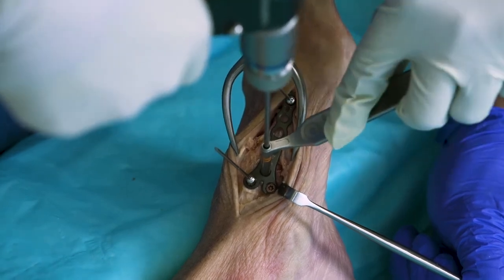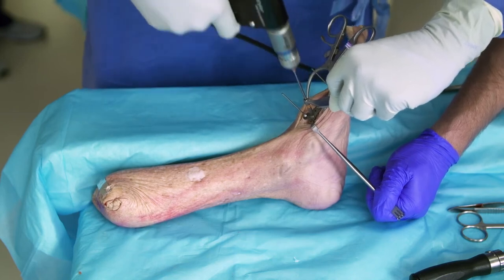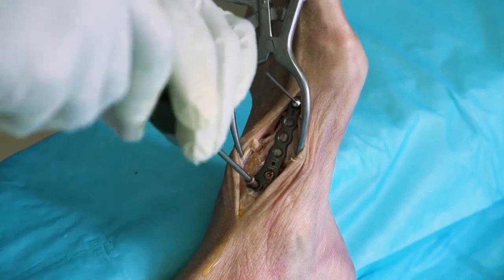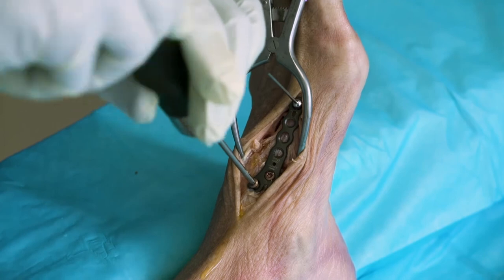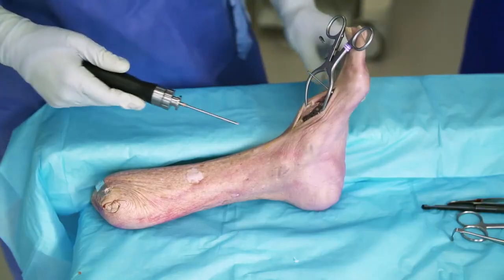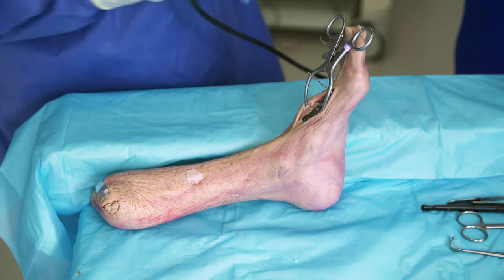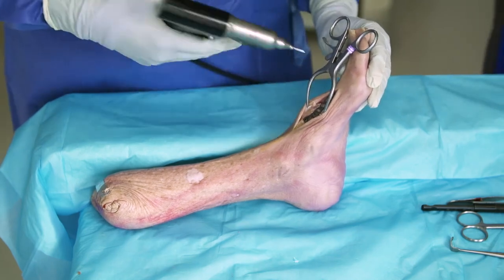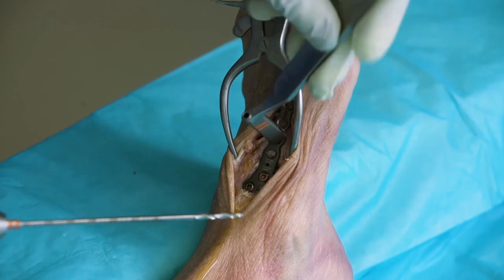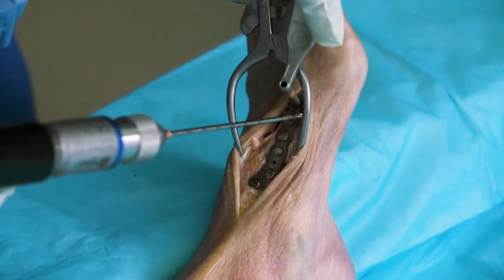You have to ensure that the screw does not cross the tarsometatarsal joint, which you can confirm on fluoroscopy. Once the screws go down, we'll have three points of fixation on this plate. The plate can't really rotate once there's fixation in more than one plane. If we were to use compression, this would be the time to use the compression sleeve — the guide instructs how to use the compression ramp, where you drill eccentrically. Since we're not going to put this in compression, we will start with our most distal screw.